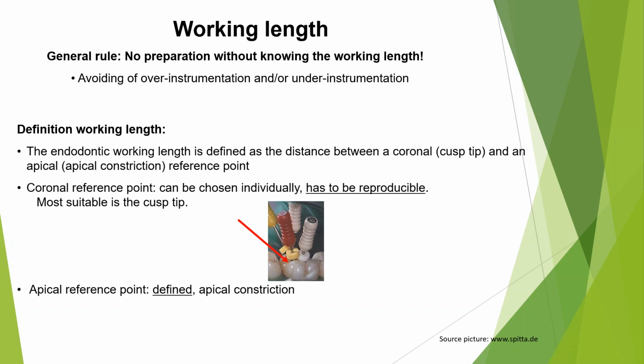Between a coronal and apical reference point. And typically in the coronal region, you're going to be using a cusp tip. And then in the apical region, it is the apical constriction. All right.